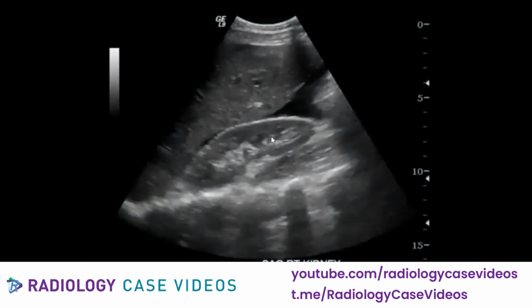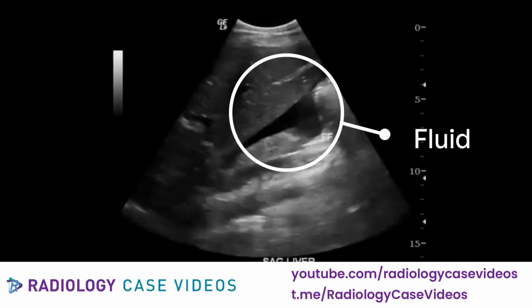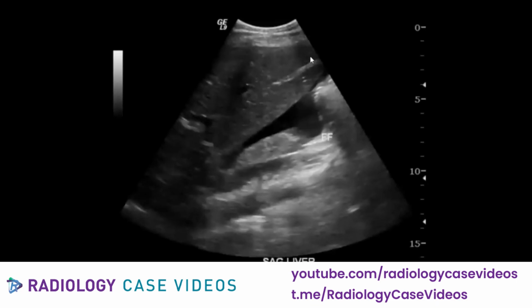So here we see a sagittal ultrasound imaging of the right kidney. The kidney appears to be of normal renal dimension, echogenicity, and location, with no renal cysts or hydronephrosis. We can see fluid in the hepatorenal pouch. There's no increased echogenicity of the liver. The liver surface appears to be smooth.